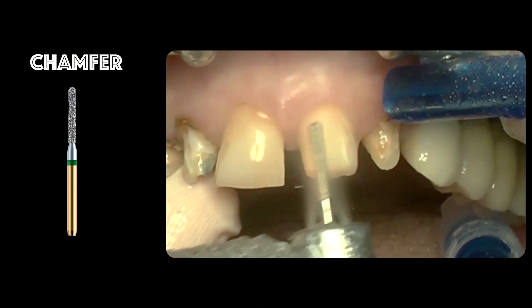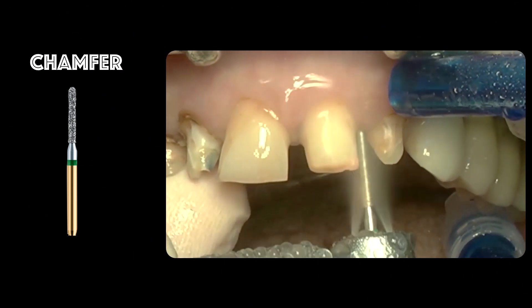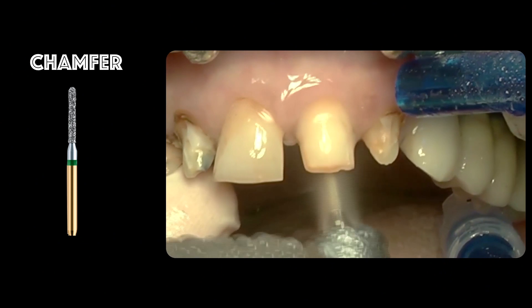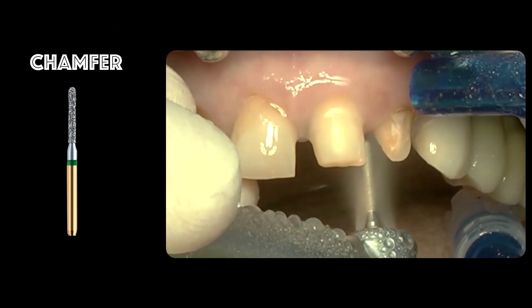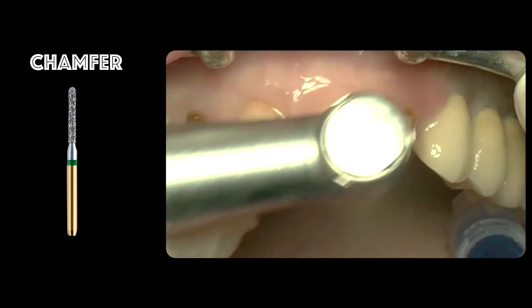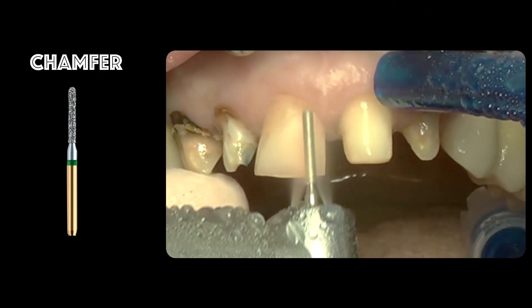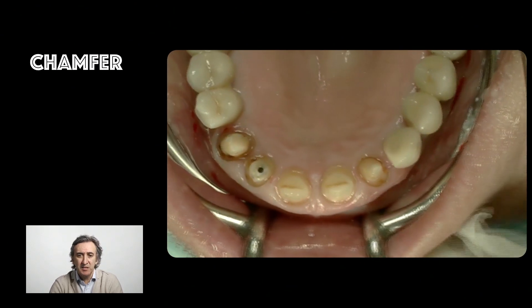The tooth preparation is performed like this — we are working with a chamfer bur. As you can see, I don't even touch the soft tissue; I just work above it, reducing the incisal margin, and moving now to the next tooth.